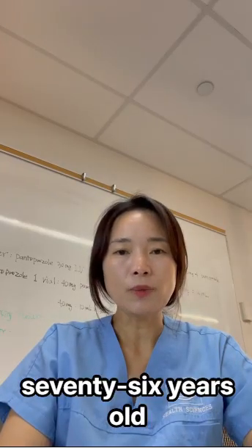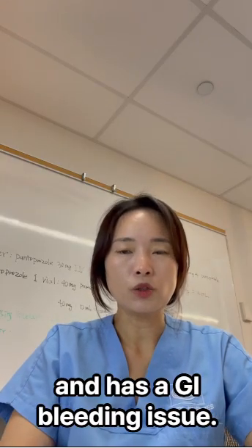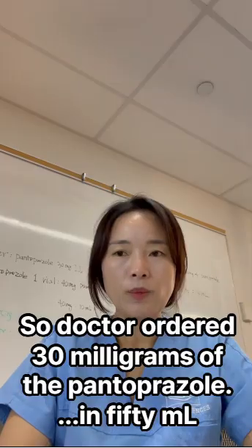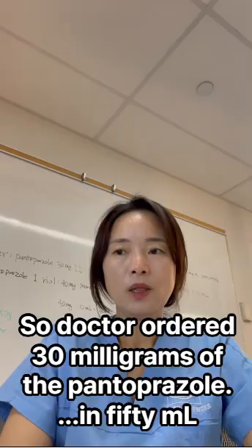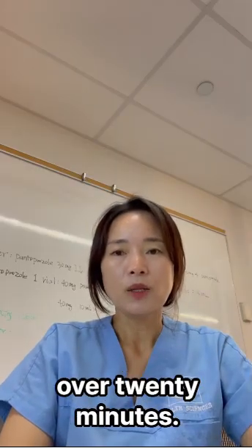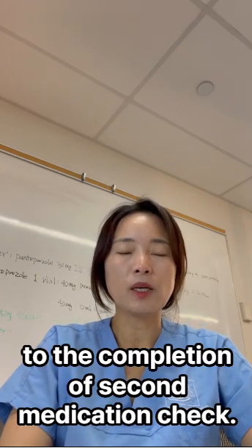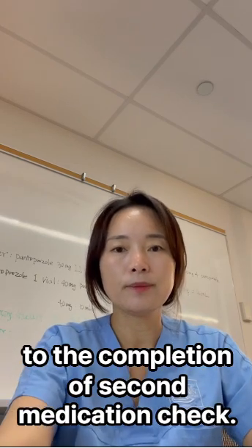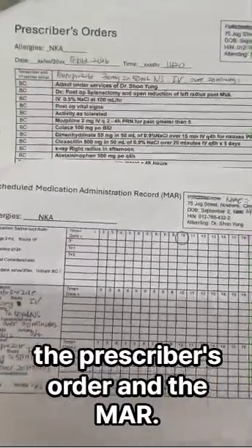Singh. He's 76 years old and has a GI bleeding issue. The doctor ordered 30 milligrams of pantoprazole IV in 50 milliliters over 20 minutes. This demonstration will go up to the completion of the second medication check. First, I'm going to check the prescriber's order and the MAR.